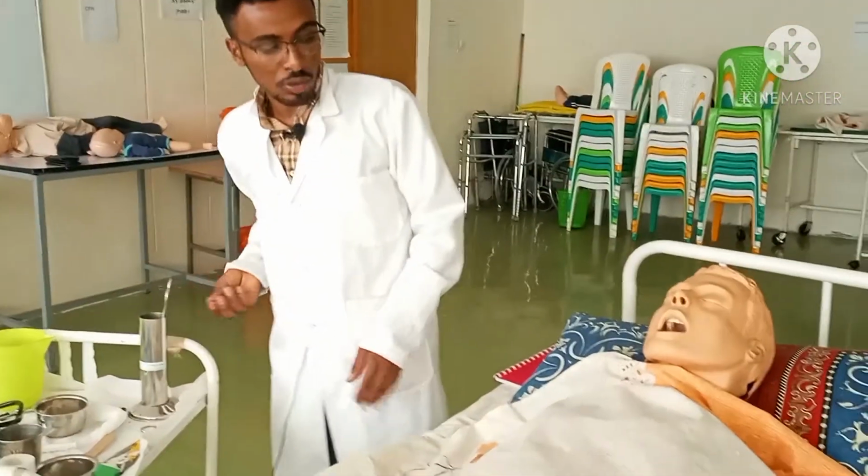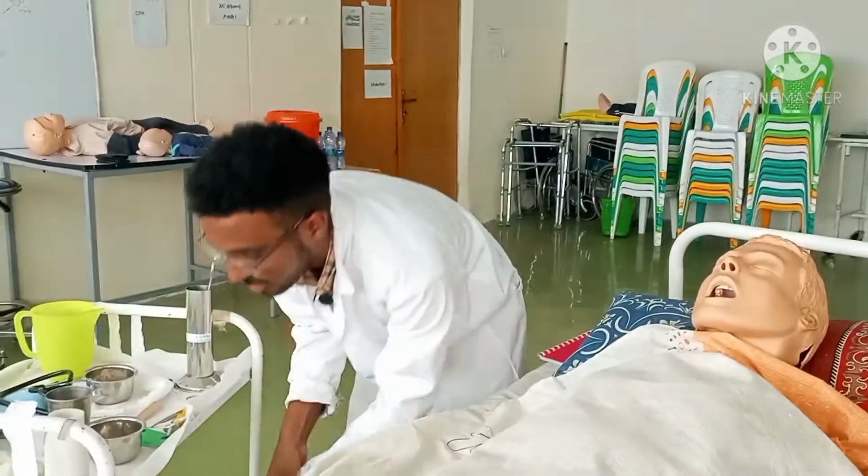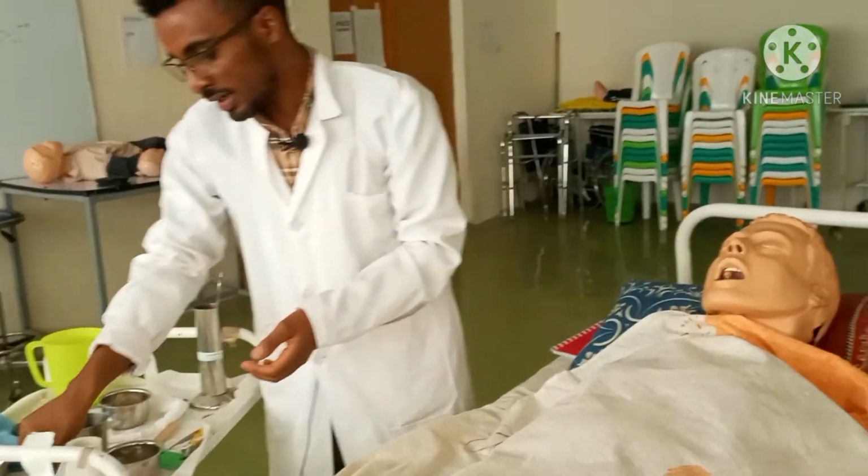So before performing any procedure, don't forget to wash your hands or use alcohol hand rub. Then you have to wear a clean glove.